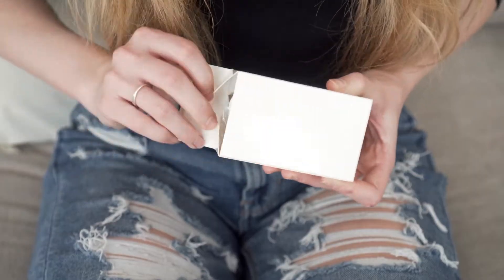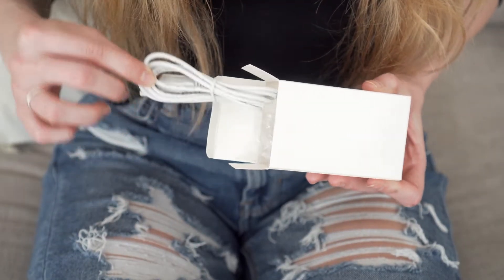Hey guys, let me tell you about the top indoor water flosser. This is the packaging — it comes with a USB charging cable and three replacement tips, so this is going to last you a very long time.